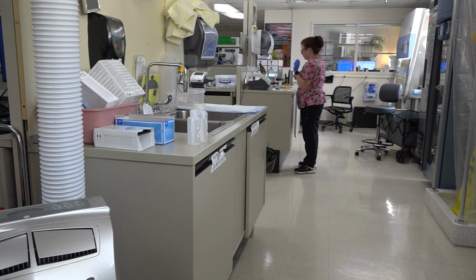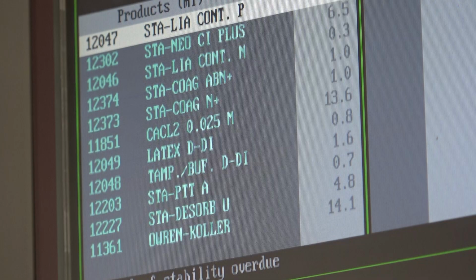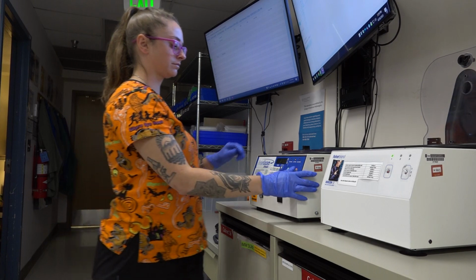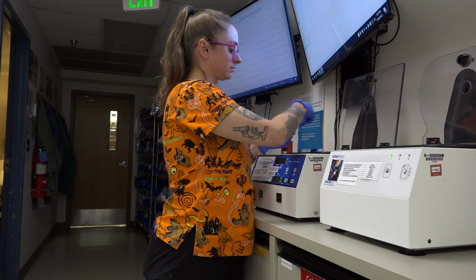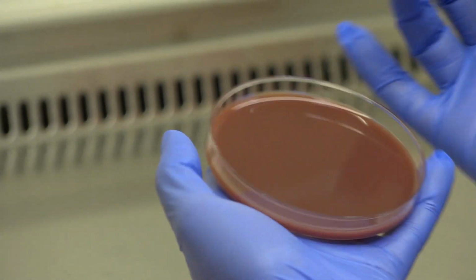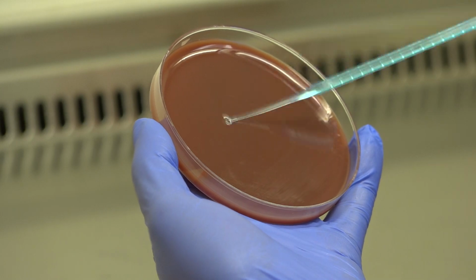Every sample of blood, urine, other fluids, or stool winds up in the lab, where hundreds of tests can be performed on sophisticated instruments. And so all the machines you see around here are different platforms for different tests, depending on what your doctor orders, and then we run it on a certain machine with certain parameters, verifying that the results are accurate before we give them to your provider, and then your provider makes medical decisions off of those results.